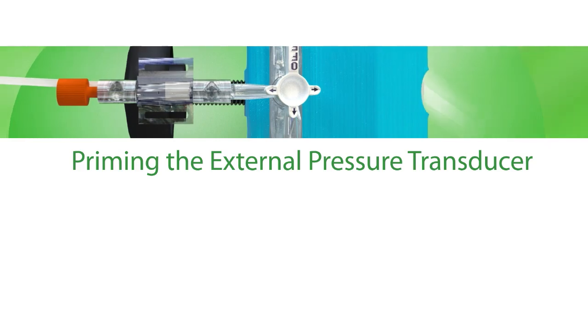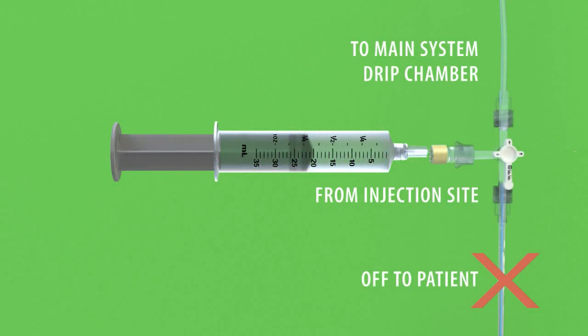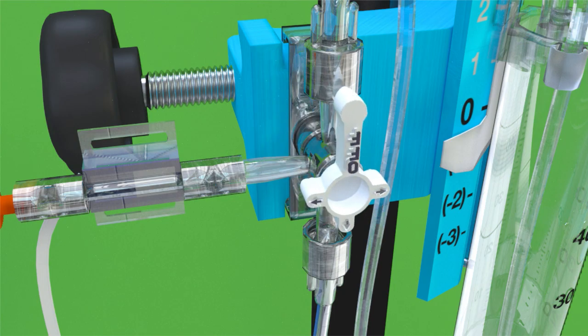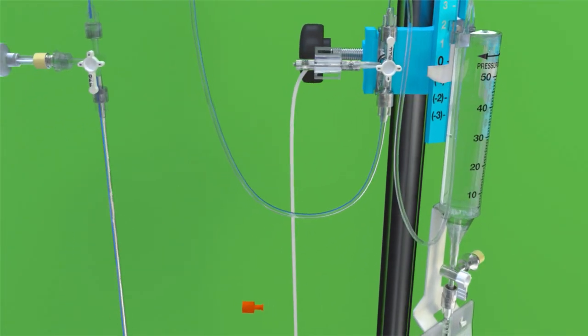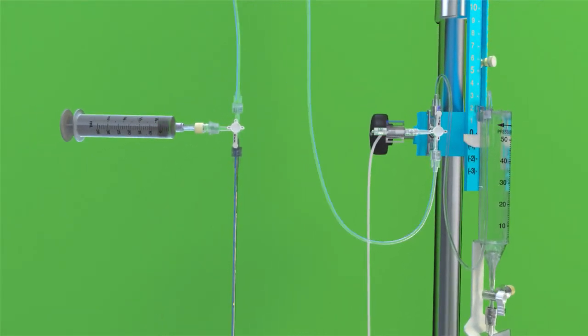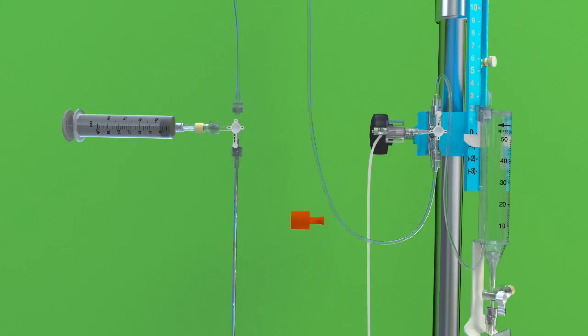Priming the External Pressure Transducer. If you are using an external pressure transducer, it will need to be primed as well. Make sure the patient line stopcock is positioned so that fluid can be pushed from the injection site in the direction of the drip chamber. Rotate the main system stopcock so that it is off to the drip chamber, allowing fluid to be pushed to the external pressure transducer. Using sterile technique, loosen or remove the end cap on the transducer. With the syringe still connected to the patient line stopcock, push the sterile saline solution through the inner tubing of the transducer and ensure that all air bubbles have been removed. Replace the end cap on the transducer.